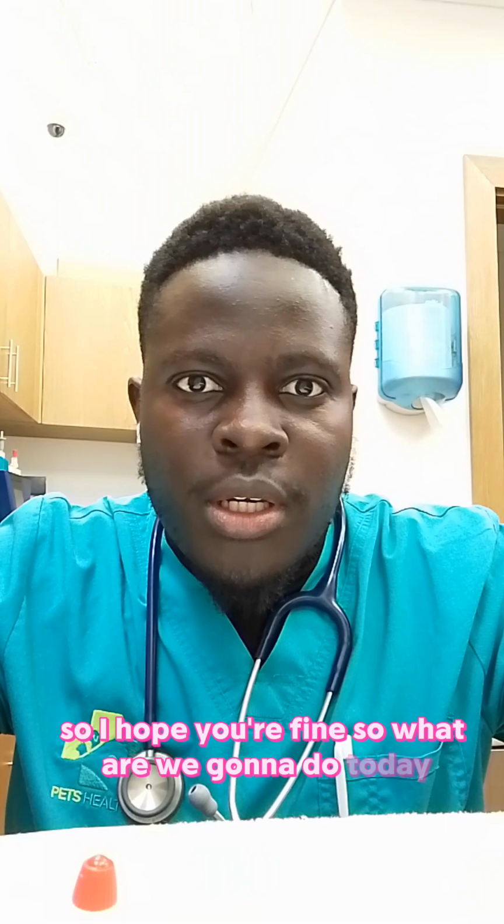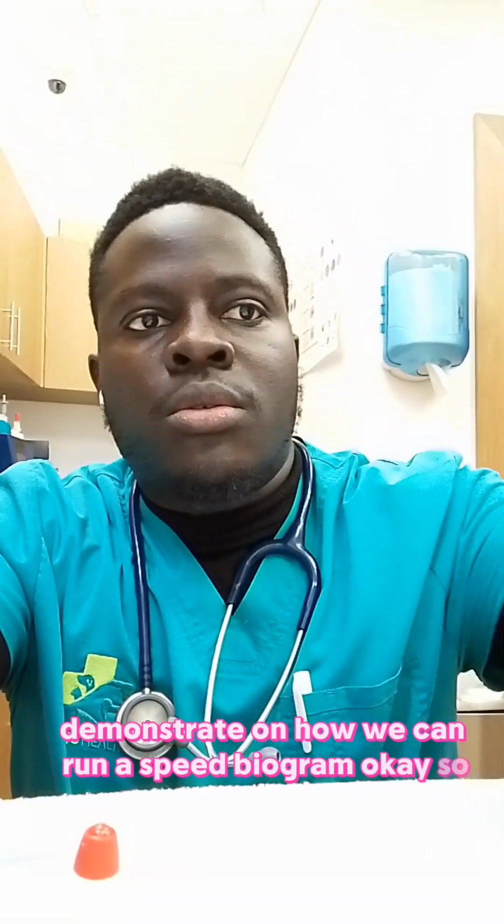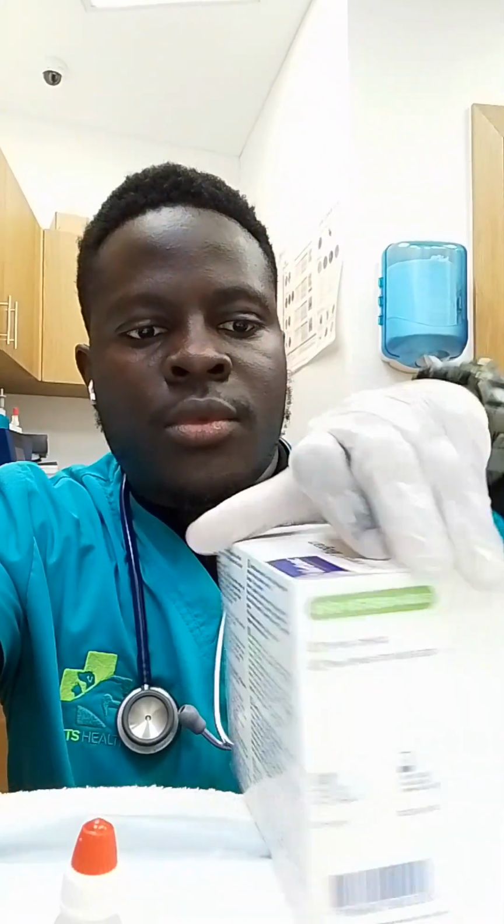So what we're going to do today, I'm just going to demonstrate how we can run a SpeedBiogram. Okay, so this is a SpeedBiogram.